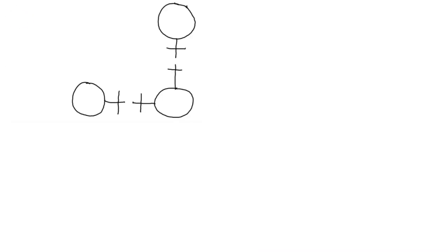So that's awesome. So what I want to do is I want to go to the whiteboard now, and I want to draw a picture to kind of help illustrate this point. So whenever you think about looking at a manual keratometer, what you're actually viewing whenever you look in the ocular there, this is kind of a representation of what you're seeing, right? You kind of see three circles, and then you see a circle down here on the right that has two lines to it that cross, and you have two circles that just have one line that crosses, right?